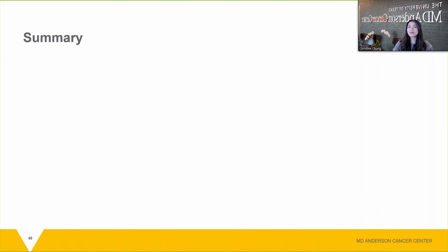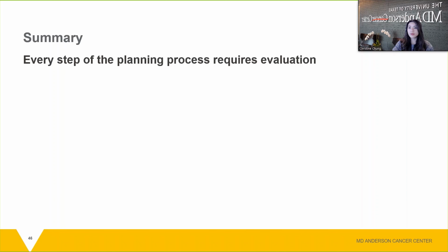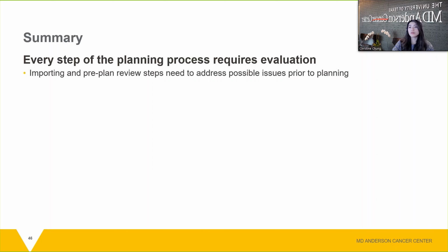All right, so you've made it to the end of my presentation. Thank you so much for hanging in there with me. So we'll just go through a quick overview and then we'll head straight into the Q&A. Every step of the planning process requires evaluation. It's really here that you'll see all the differences between the patients that makes it difficult to employ the same exact method. So the importing and pre-plan review needs to address possible issues prior to the planning.